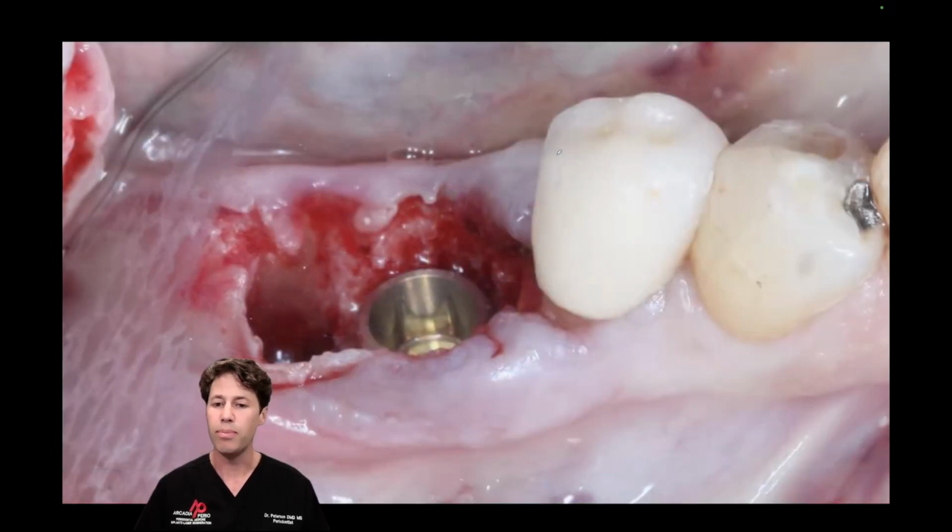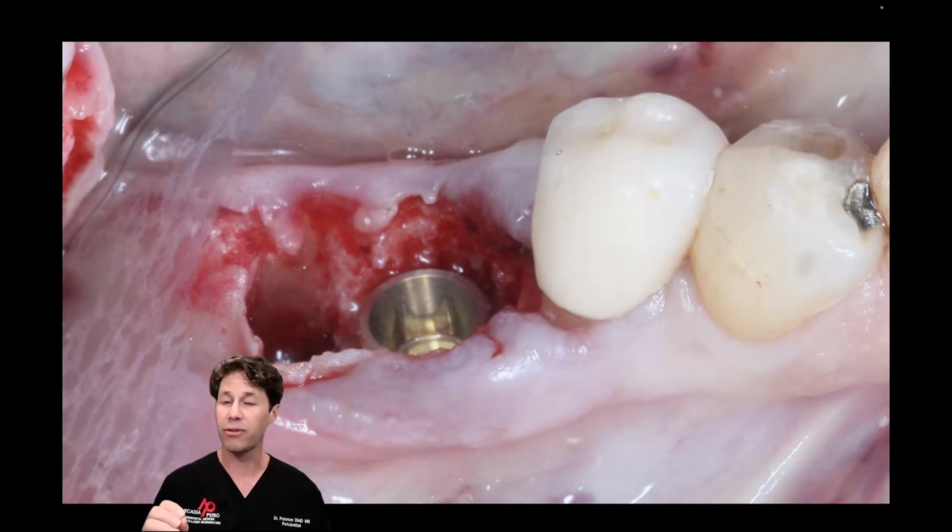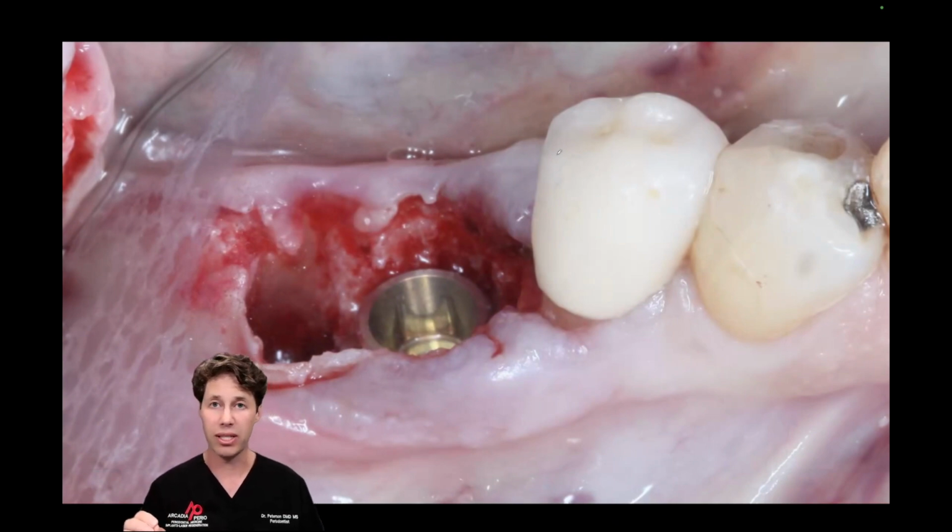So here we are, minimal flap reflection. The implant is placed into that mesial root, and we have good initial torque. Sometimes I will elect for an active over a parallel in this case, but I knew the bone quality was good based off of the CBCT. My preferred implant line is a Nobel Parallel. It just works best in my hands.